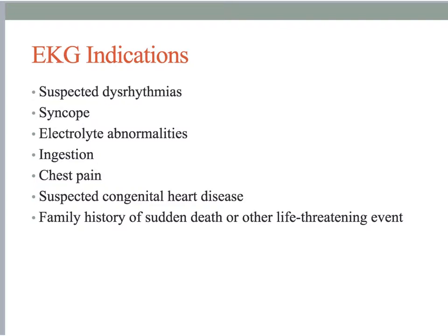Some indications for EKGs include suspected dysrhythmias, syncope, electrolyte abnormalities, ingestions, chest pain, suspected congenital heart disease, and screening in patients with a family history of sudden death or other life-threatening event.